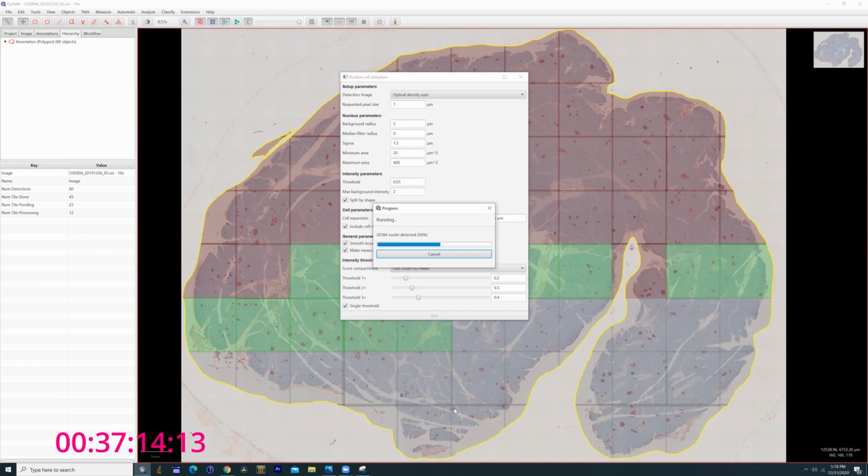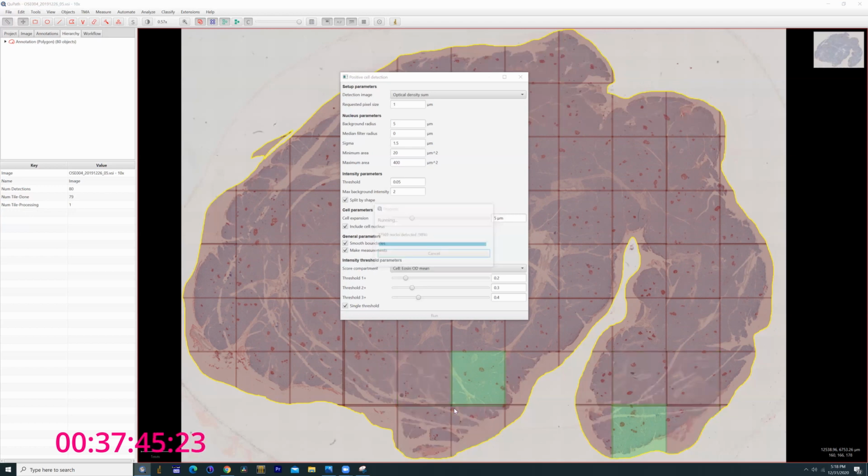There are probably a number of tools built in if you go to the main website where you can refine your selection more. But honestly, for large scale scanning of hundreds of sections, I try not to do this too much, because the more you manipulate the image by controlling which sections are scanned, as long as they're within the parameters of the screen, the more likely you are to generate artifacts. So I like the idea of a gross number. It's really very reproducible and representative of the data set. We're almost there.